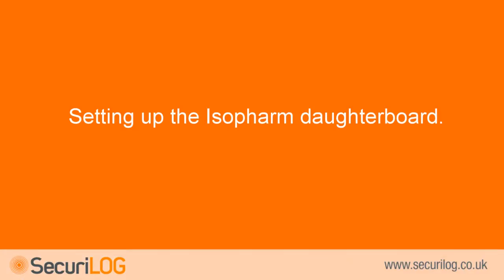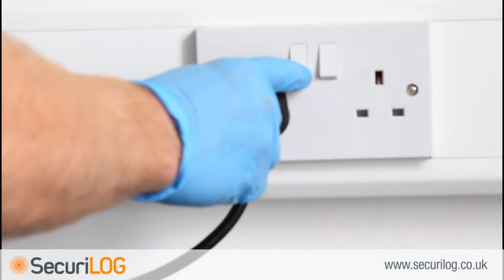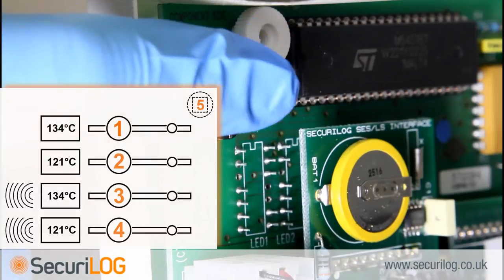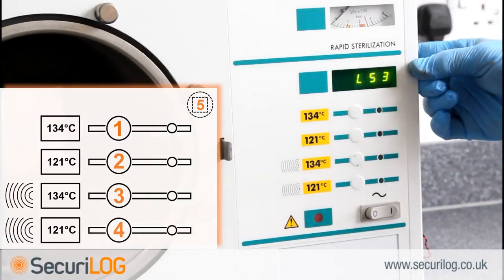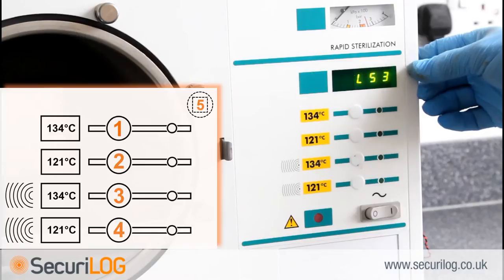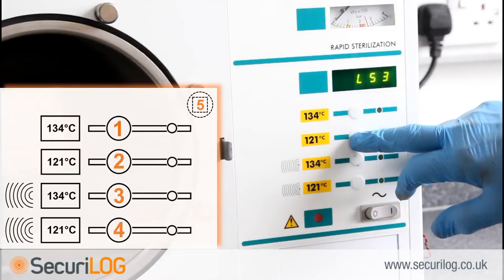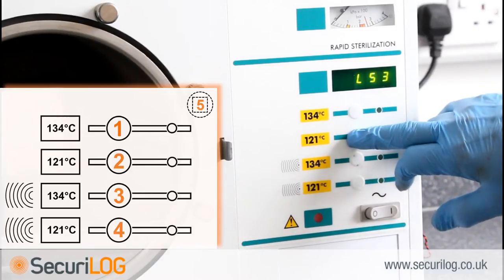Setting up the isopharm daughterboard. To enter programming mode and turn on the printer function, plug the steriliser back into the mains. Be aware that the machine is now live without the cover in place. Hold button 5 on the reverse of the front panel and switch mains on, keeping button 5 pressed until the display reads 'setup'. LS3 will then display. If the unit is an SES-2000, press button 2 to bring up SES.